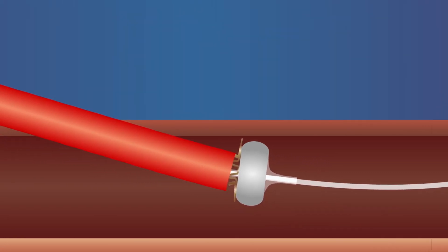The delivery system also includes a positioning balloon. The uninflated positioning balloon is advanced so that it is located a few millimeters downstream from the tip of the red delivery system catheter. The sheath is removed. Then the delivery system is carefully retracted to deploy only the tine portion of the connector. Next, the positioning balloon is inflated and retracted to engage the tines. The balloon and tines are gently retracted together so that the tines are flush with the artery wall.